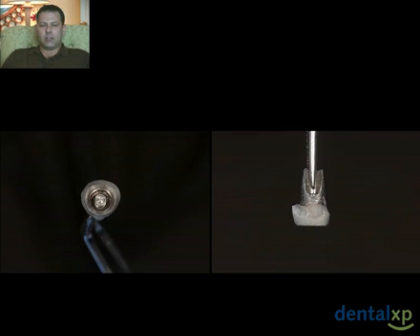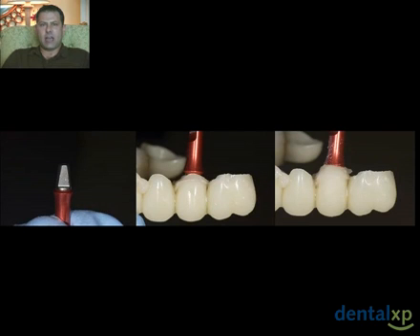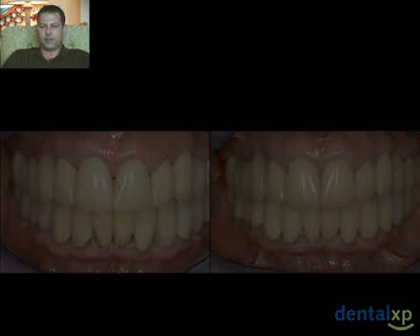This is what the temporary abutment looks like after preparation. You can see that just adding a little bit of composite really has changed the facial aspect of that canine. On the other side, if you have solid abutments, you can do this by relining in the mouth, then getting the analog and another final abutment of the same shape, and then adding acrylic cervically to close that area and shape the emergence profile of that temporary.